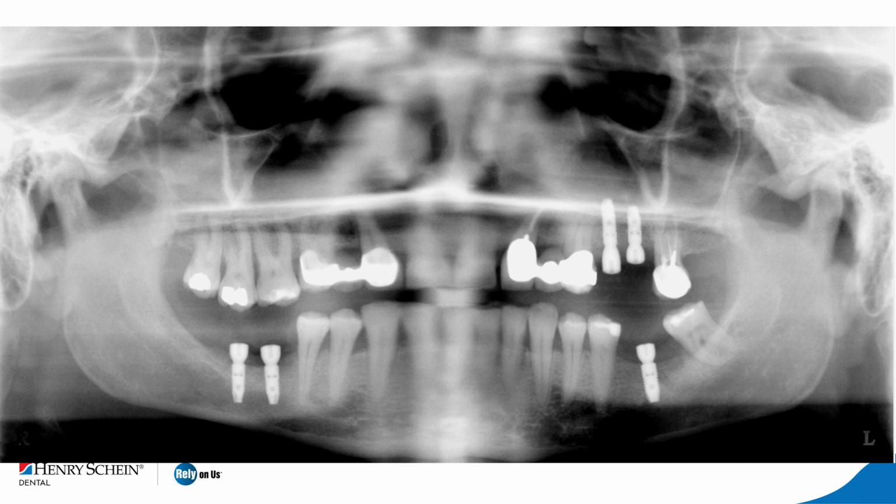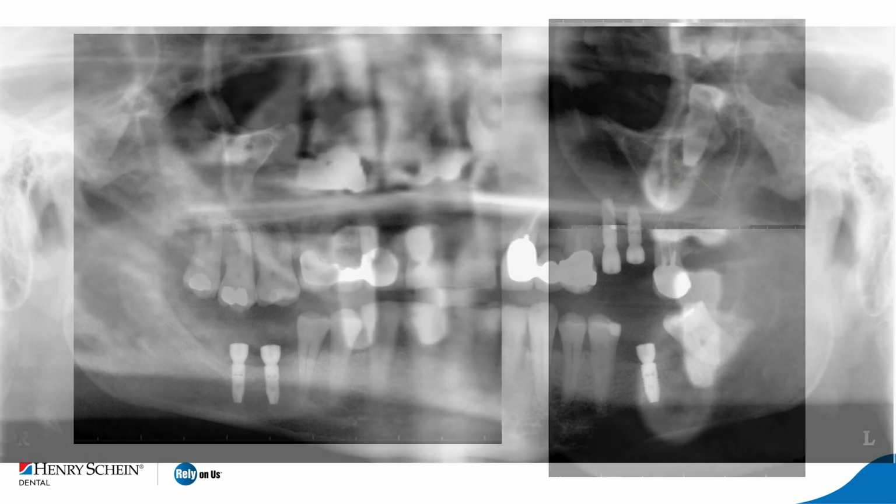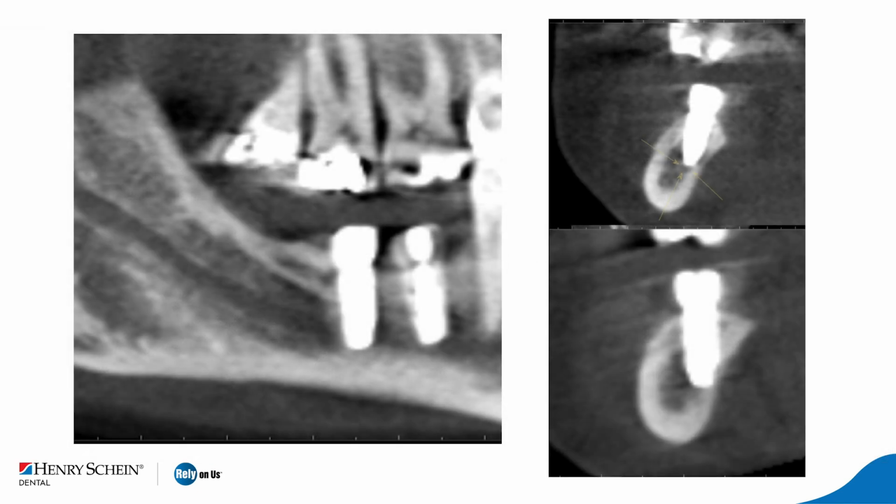So the surgeon did nice on the left side of the patient, placed 3 well osseointegrated implant, and did a bone graft on the right aspect of the jaw, ramus graft that osseointegrated very well as well. But when he placed the implant on the right side, the mandibular canal was coursing more lingually, unfortunately. And those implants, the apical part of the implant did damage the mandibular canal, and the patient experienced some numbness.